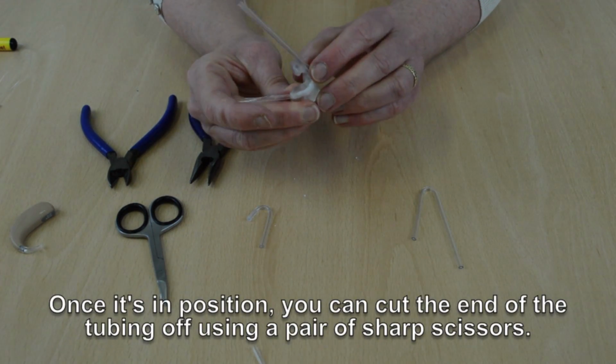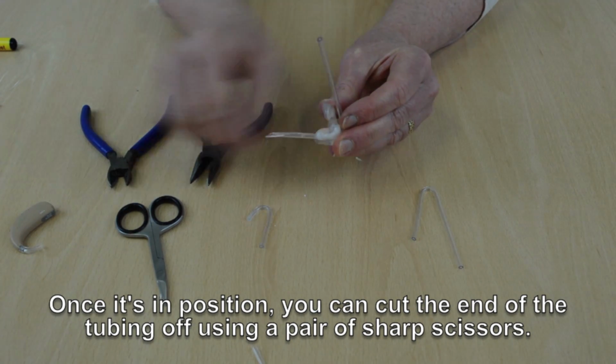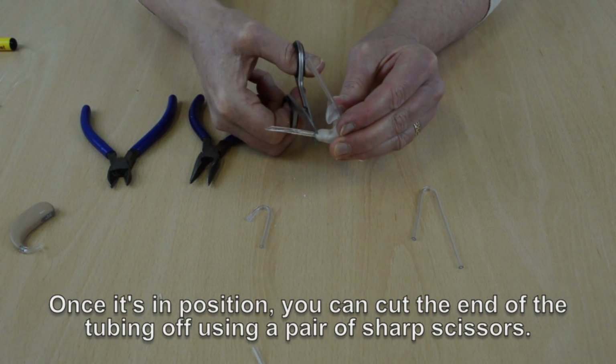When it's in the right position, you can cut the end of the tubing off on the inside of the ear mould using a pair of sharp scissors.